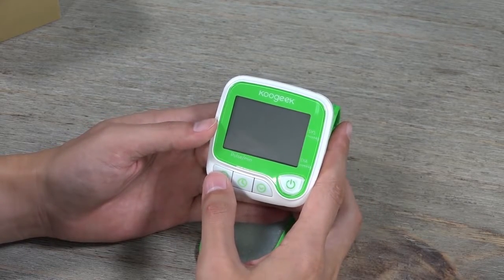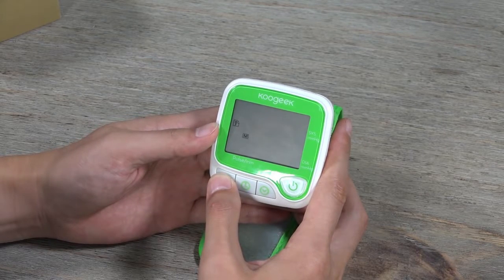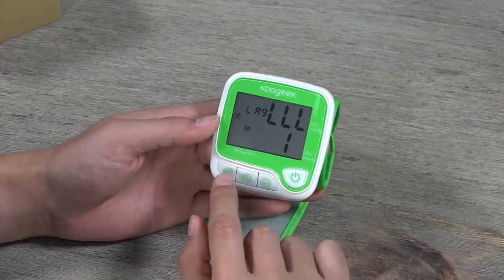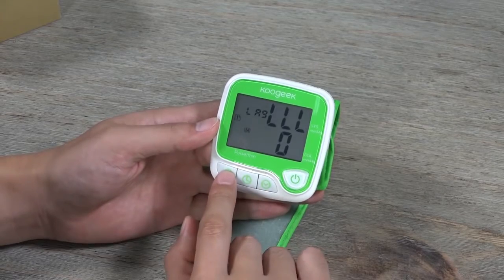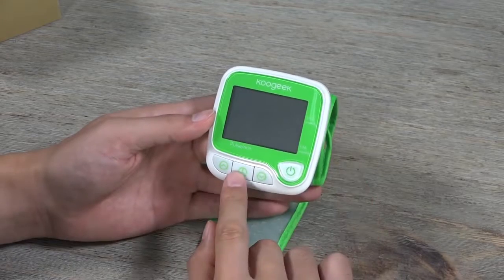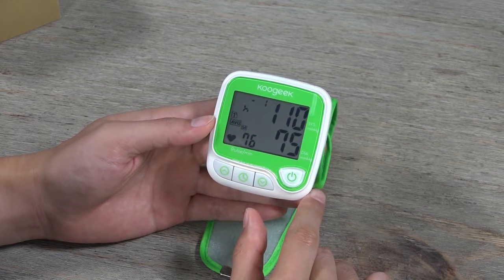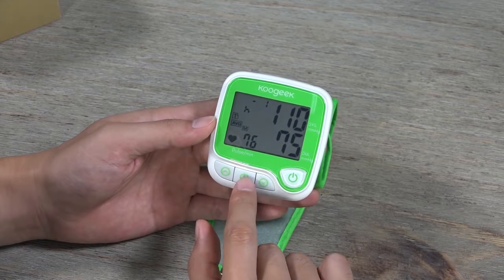Instead of pressing once, if you press and hold for a couple of seconds, you'll be directed into the language change — with three language choices. And there is another button: if you press it once, it shows the average of your recent measurements — for example, systolic 110 mmHg, diastolic 75 mmHg, pulse 76.